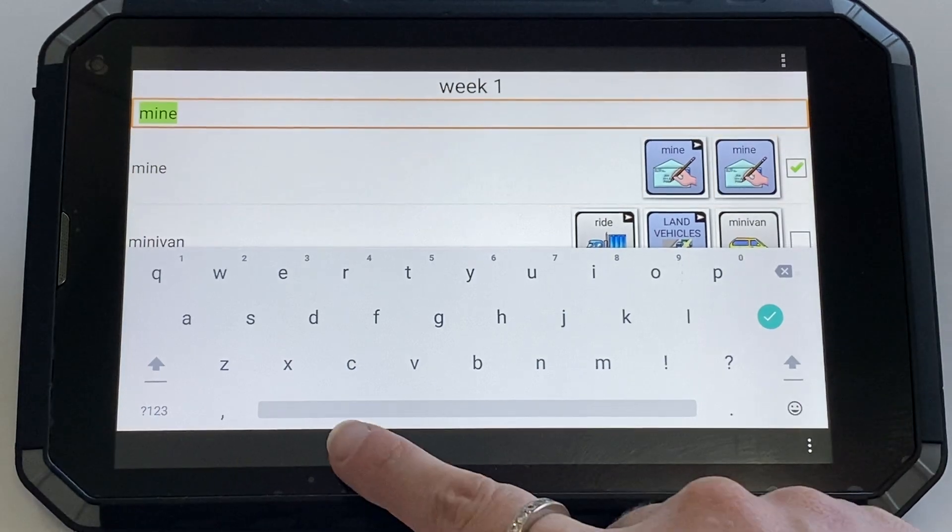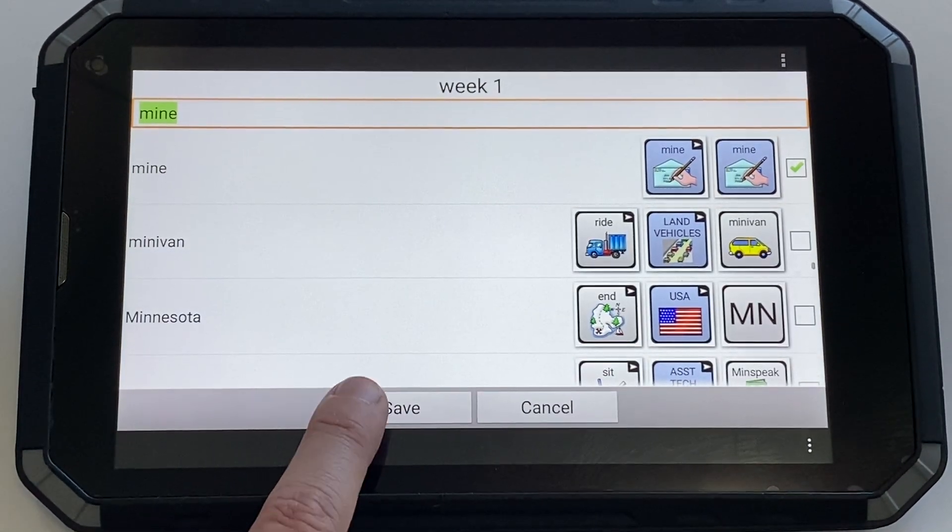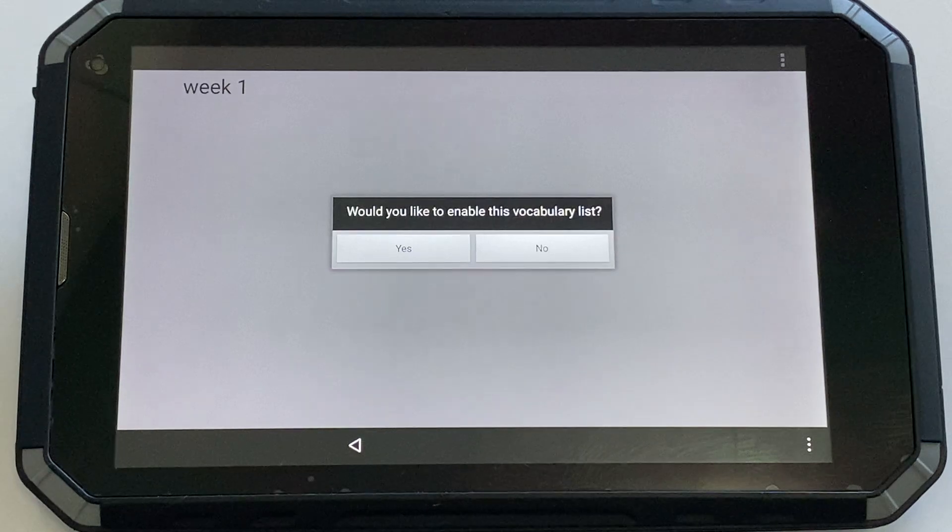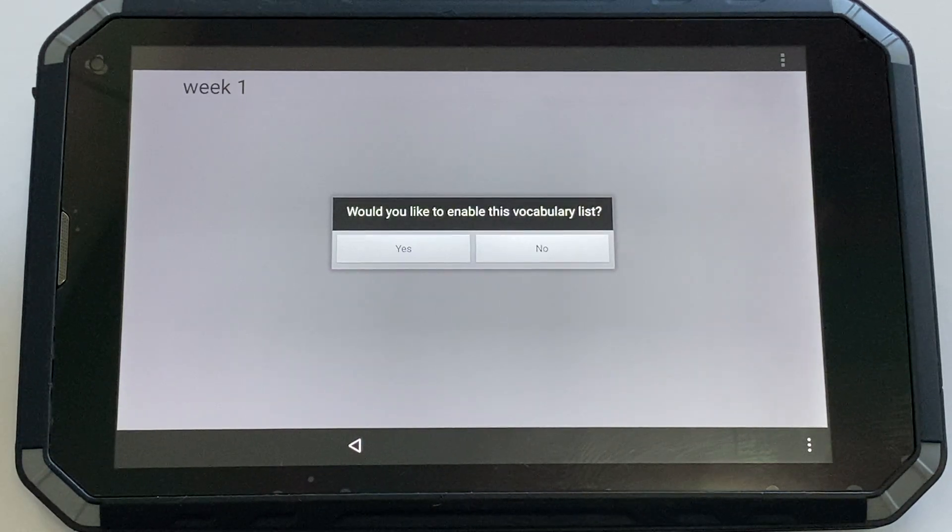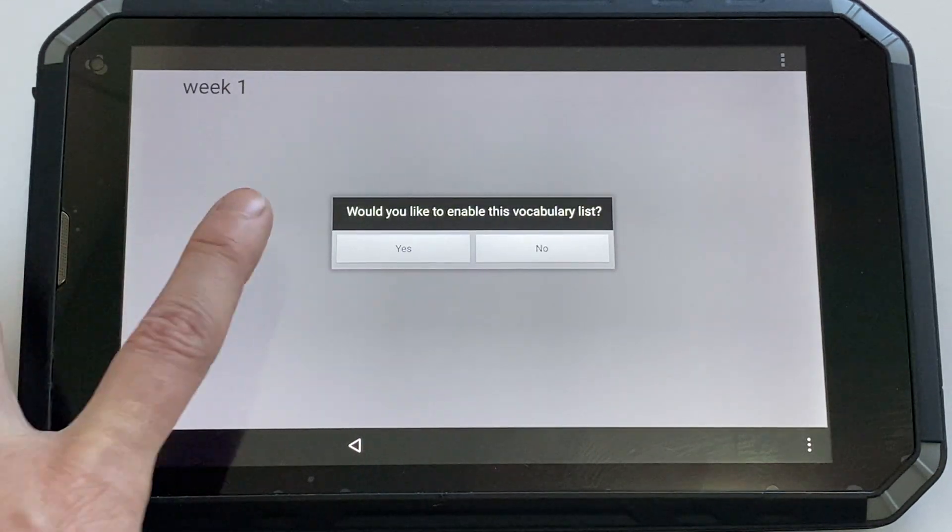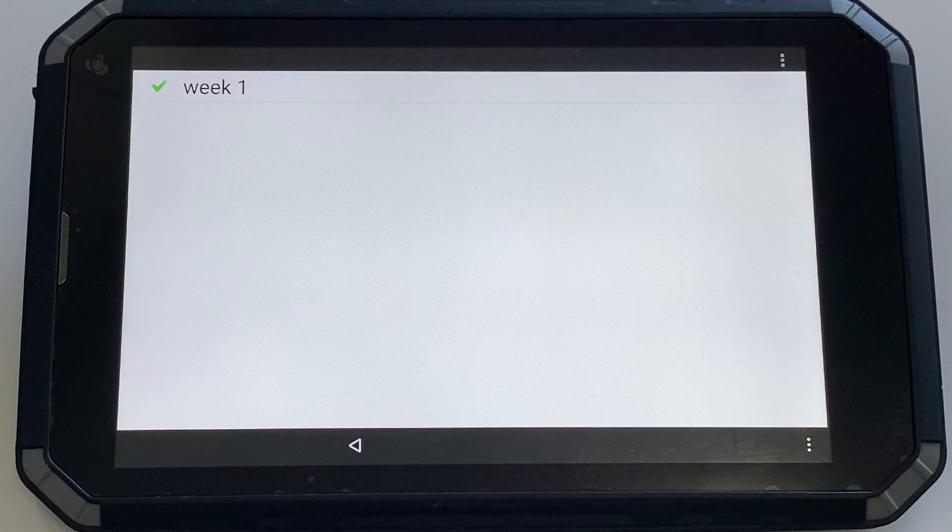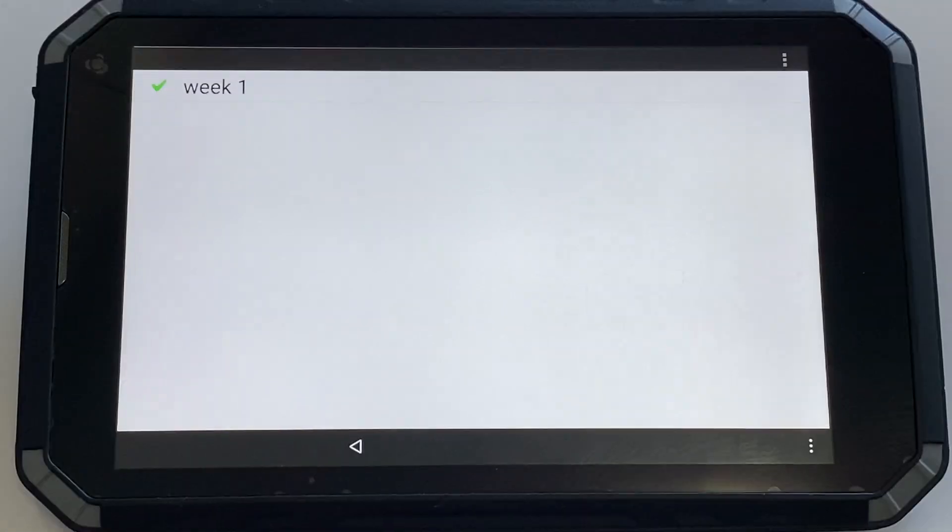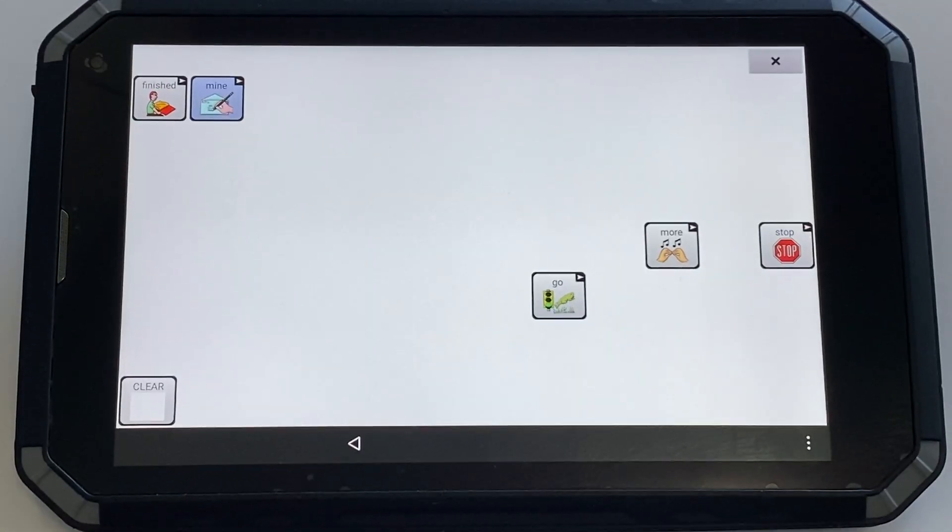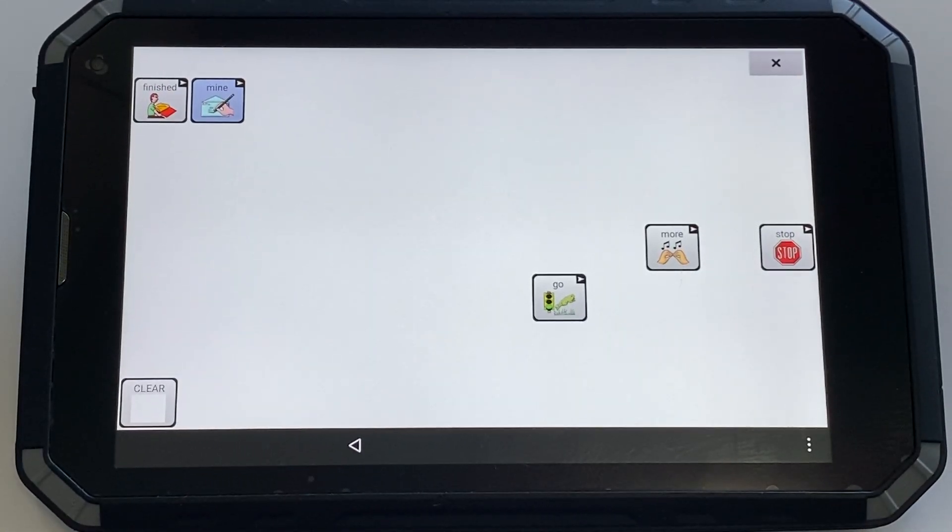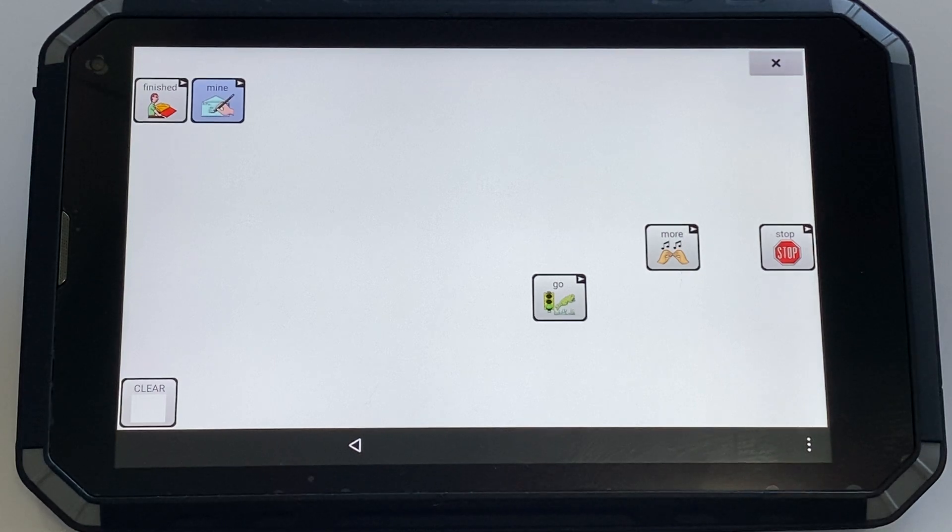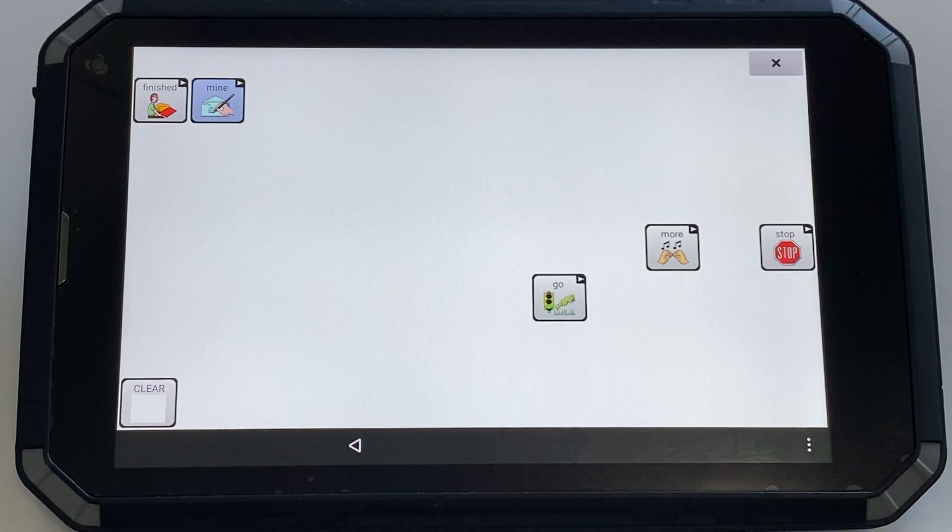Once you're finished, you can hit save. You'll then be prompted, would you like to enable this vocabulary list? You can select yes. You'll see a green tick. Head back. Now, you'll see that list has been enabled and only those target words are available to select.